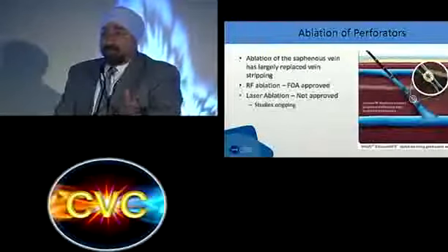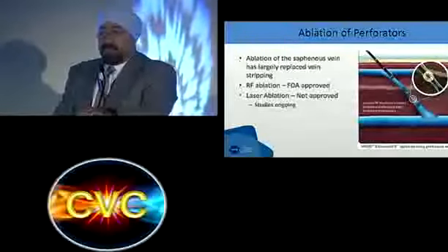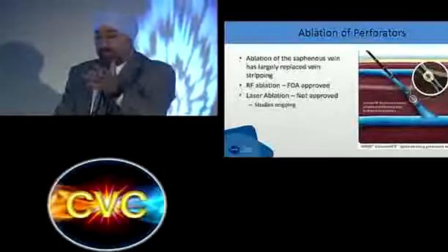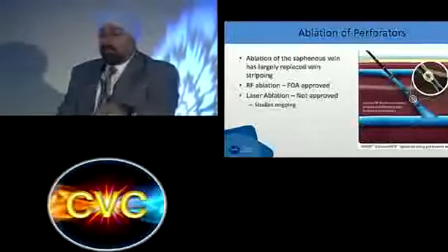This is really spot welding, so with ultrasound you find where the spot is. They have a certain technique that they propose, but most operators will find a way to adjust it to what works for them and how much they need to use.